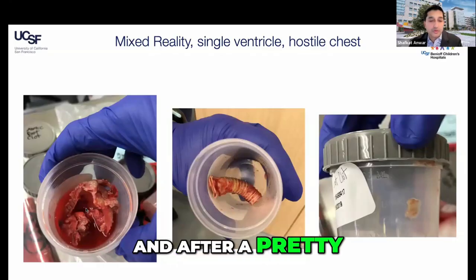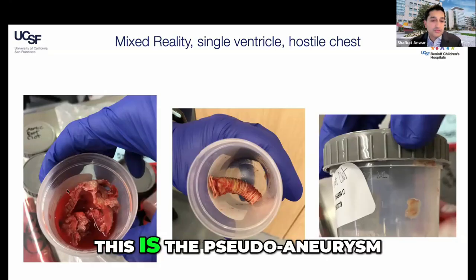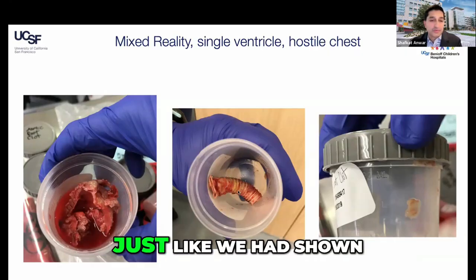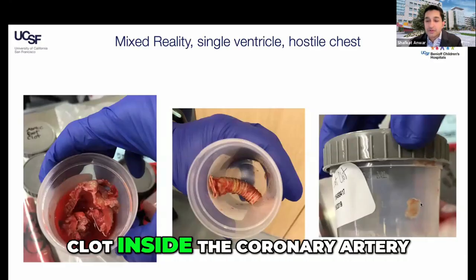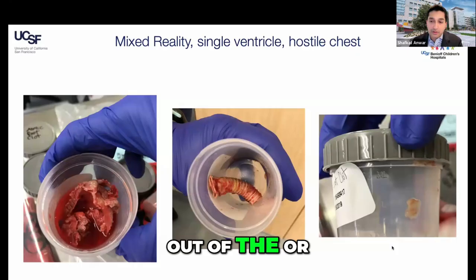And after a pretty quick planning session with the surgeons, this is what they found. This is the pseudoaneurysm and the clot inside it that they resected. This is the LPA graft, just like we had shown. And this is the clot inside the coronary artery. All went according to plan. The patient made it out of the OR.